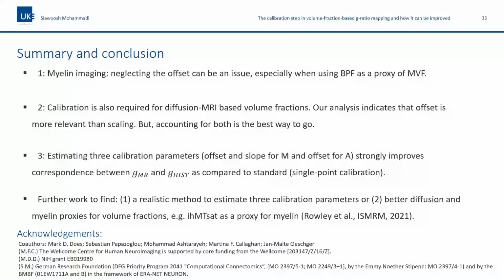I think that we can start. So I showed two projects, one where we were using the rotations, the other one where we're doing multi-compartment relaxometry, where we were trying to help our fitting using the fact that myelin water has a very different T1 from free water, and I think mixing the two actually might work. So in one project we use the orientations, but we could also maybe use the T1 as a way to resolve these problems and integrate over the fiber tract, because there is no fiber tract that is always parallel to the magnetic field, apart from probably the corticospinal tracts, but even those ones bend a bit.